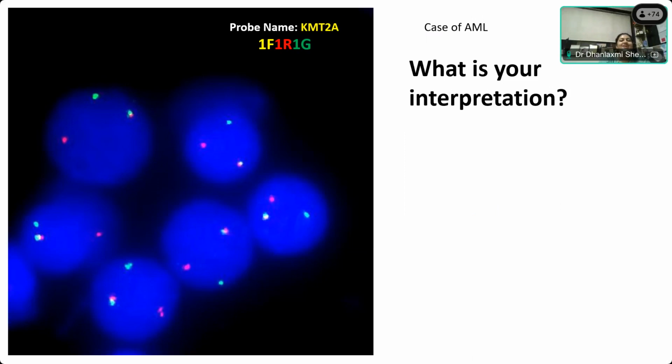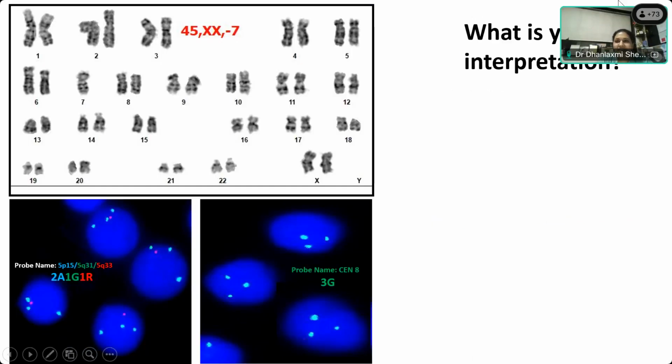Most of the audience has answered positive for KMT2A also. Yes, they are right. The answer is positive for KMT2A rearrangement. So we have a very good audience who has understood cytogenetics well. I'm glad about that. So here, this is one case.